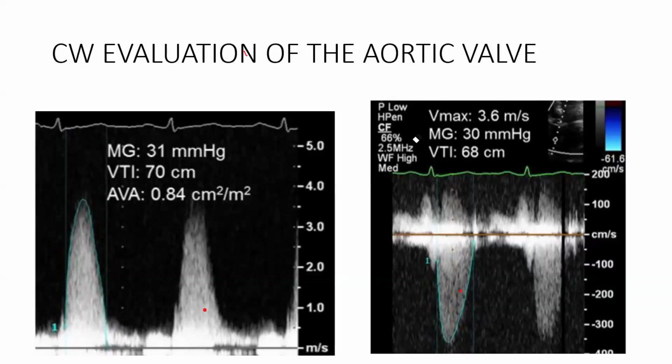You understand? Because the EF is low, that one is straight, it makes sense easily. But there's a patient whose EF is 75. It means the EF is preserved. So if the EF is preserved, ideally, the patient should be able to generate adequate flow across the valve to elicit the maximum mean gradient.